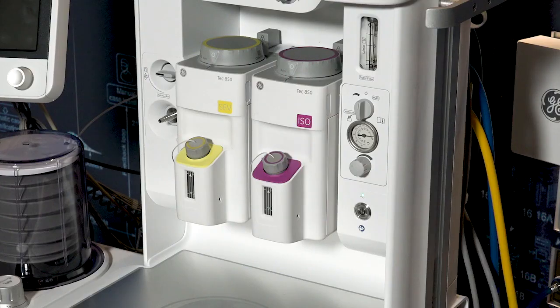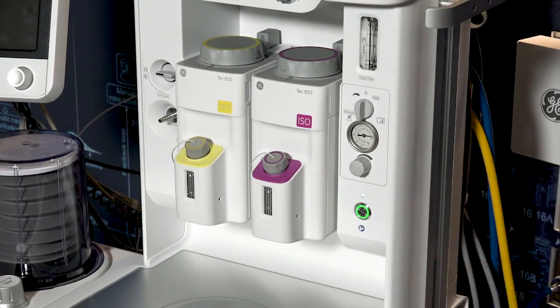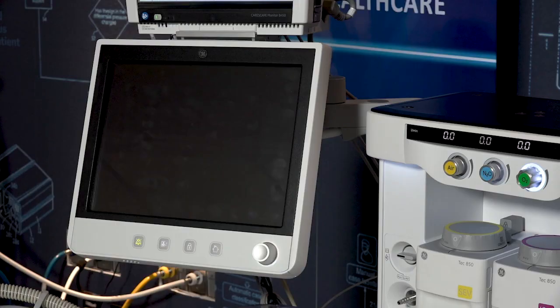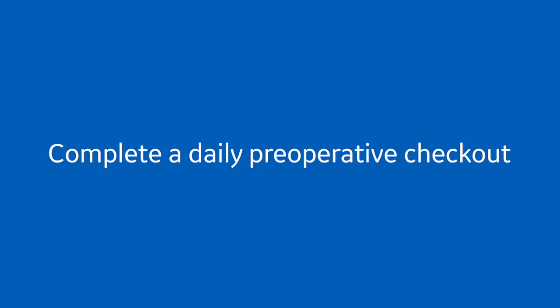Push the on or standby switch for one second to turn on the system. It will take approximately 45 seconds for the display screen to turn on. The power should be cycled once every 24 hours. Complete a daily periop checkout as described in the machine user's manual. The anesthesia machine is intended to be power cycled and fully tested once a day.